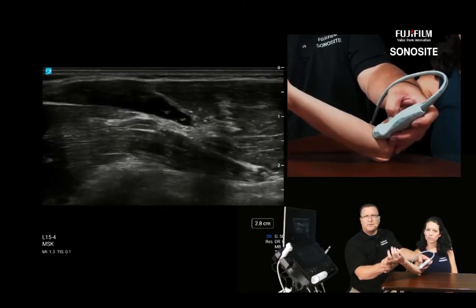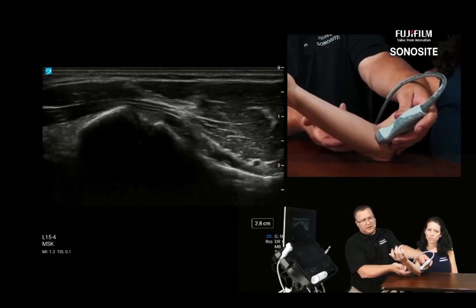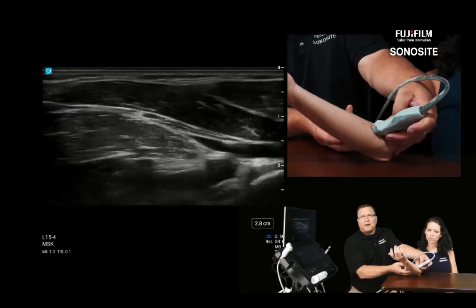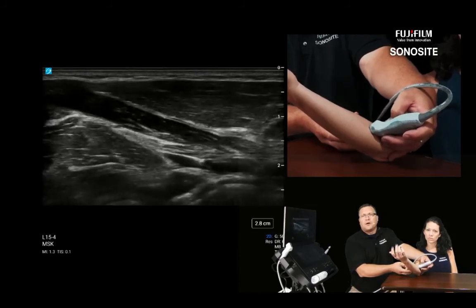Hopefully I got both cameras looking okay. Good. I'm just going to fan my beam over to the radius. The radius, I can feel it back here. So the intersection of the beam is relatively back here at my fingers. Now, remember, the ulnar branch of the brachial artery is bordering right there, the distal biceps.